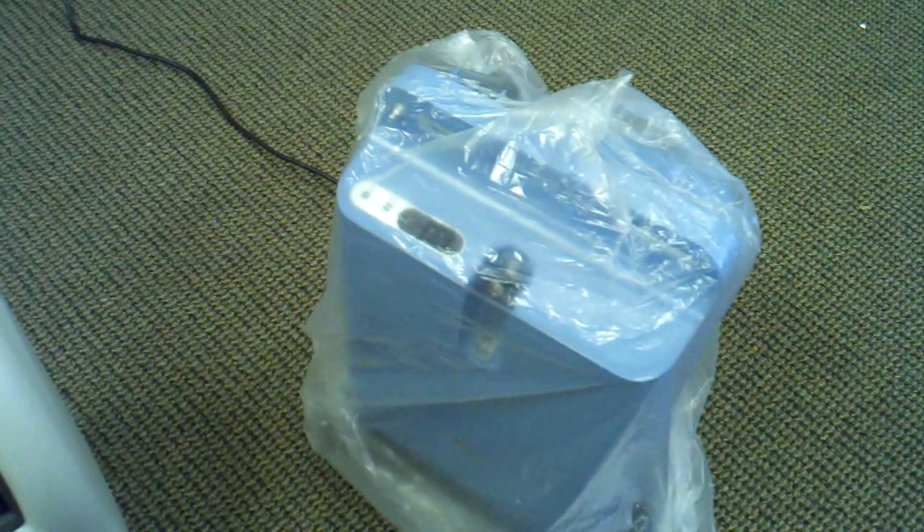The Respironics EverFlow Q right here — I have it in the plastic because I just took it out of the box. This particular one has an internal filter, but it does not need to be changed until two years. When it's shipped as a bundle kit, we ship it from our location — we do have these in stock in our warehouse here in Arizona. We always ship things out factory sealed, so you know it's brand new just from Respironics and hasn't been opened.